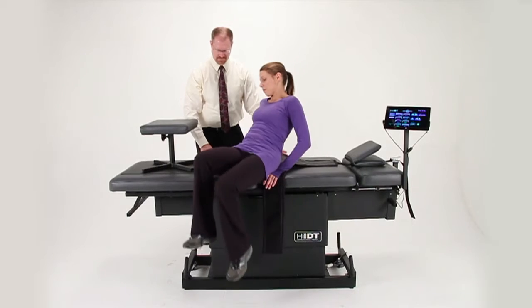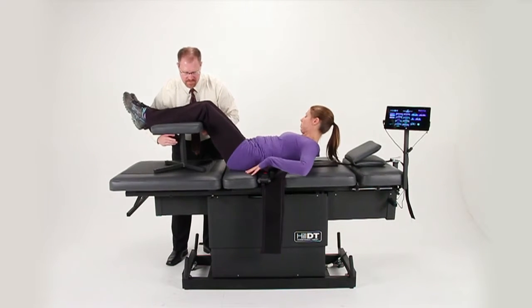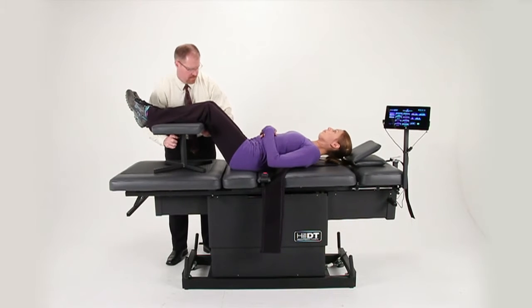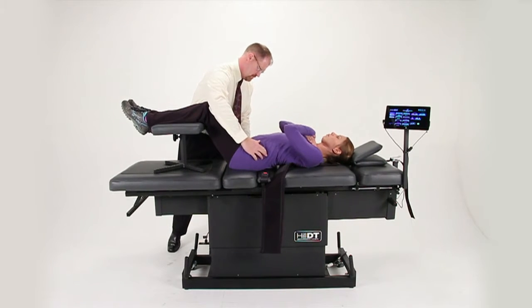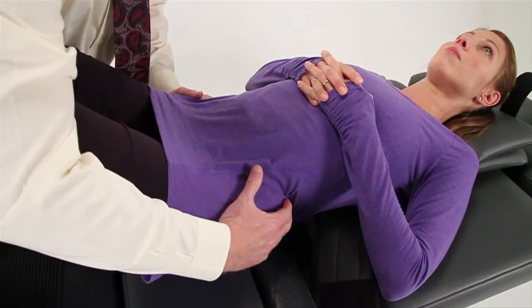For lumbar decompression, place the patient's legs up on the stool and adjust the height if needed. Position the patient so the lower half of the pelvic flex strap is above the crest of the ilium. Use the X threading on the belt as an easy guide.